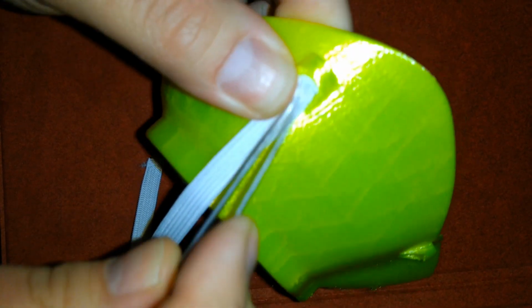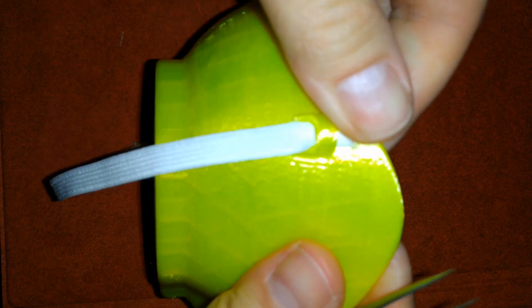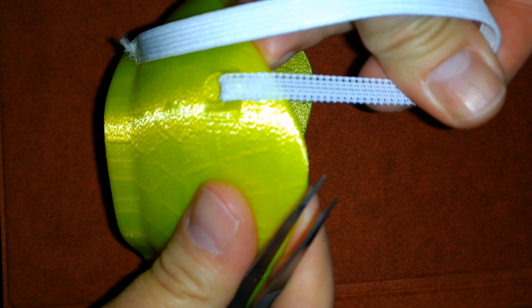Now we can push this through. Takes a little bit of effort sometimes. Once you get it through, there's not going to be a need to tie a knot in this. This TPU filament and the size of the holes holds it tight enough that you can put it on your face. And I've been doing this for days, and none of them have come out.